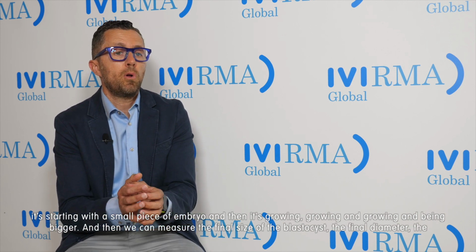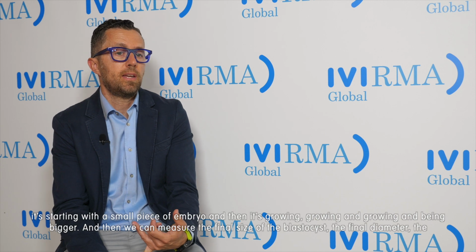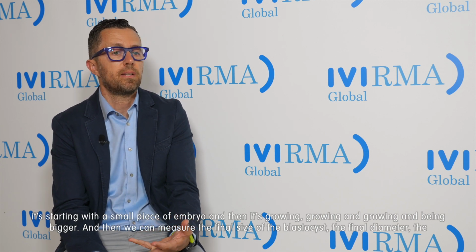In this study in particular, what we have done is record this process of 4 hours using time-lapse incubators. During these 4 hours, the embryo starts to re-expand. Initially it's collapsed, it's trying to re-expand, sometimes collapsing during the process, and it starts with a small piece of embryo, and then it's growing and becoming bigger, and then we can measure the final size of the blastocyst, the final diameter, the thickness, etc.